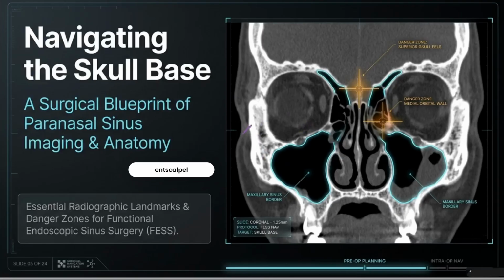But if a surgeon needs to operate inside your face, well, it's a completely different story. They are basically flying blind through this microscopic air-filled cavern system. Yeah, and that cavern system directly borders your brain and your eyes. Exactly. So that simple, comforting X-ray machine suddenly really struggles to give a clear picture of a profoundly murky anatomical landscape. Because the face isn't a solid block. It is an incredibly complex labyrinth. You're looking at this whole series of hidden, delicate cavities stacked on top of and behind each other.